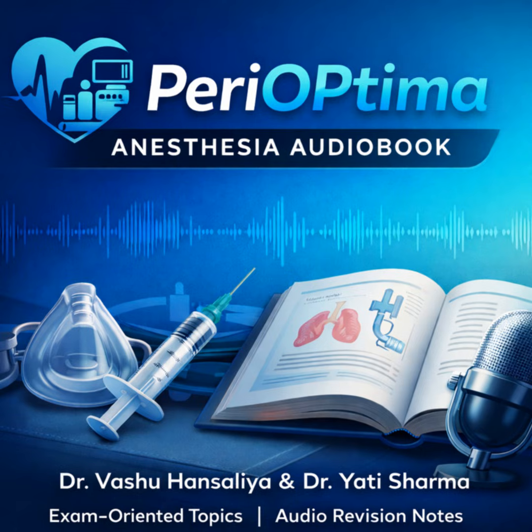And just a quick advanced point for the exam: double lumen tubes. Some studies suggest that even though VL gives a better view, the wide open space provided by a standard Macintosh blade might actually make it easier to railroad a big, bulky DLT in a normal airway. Better view doesn't always mean easier passage.